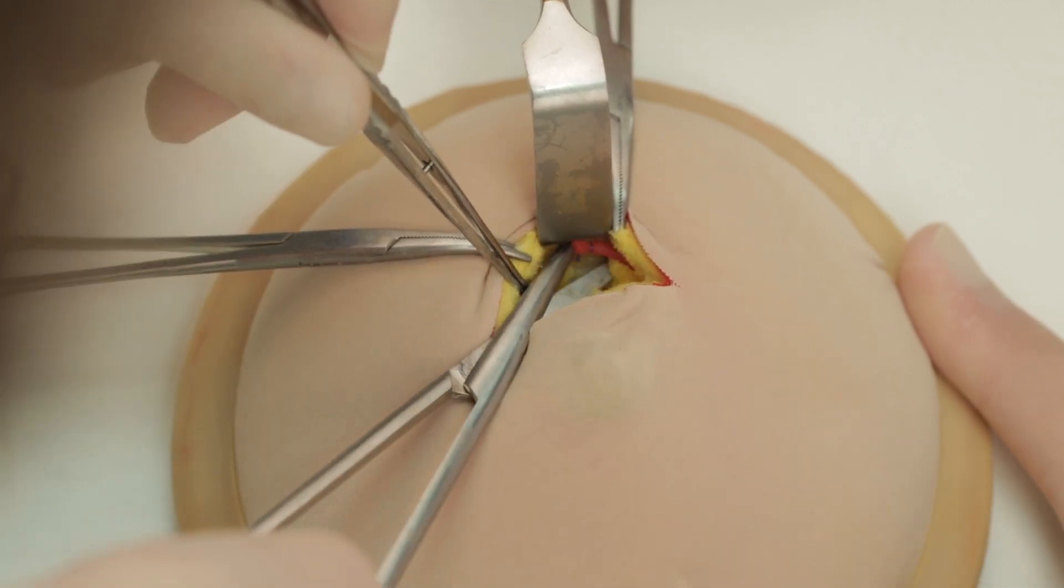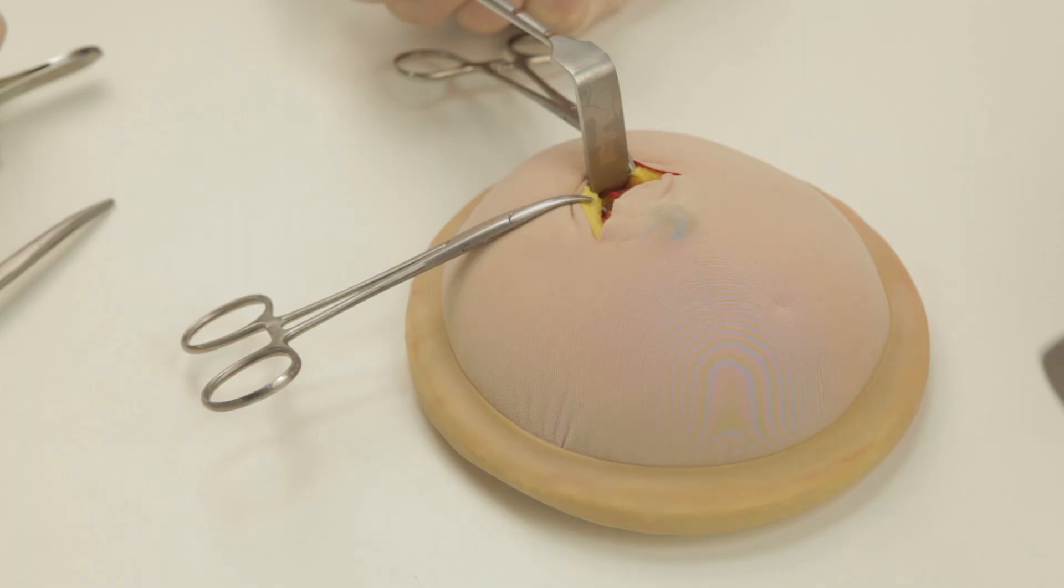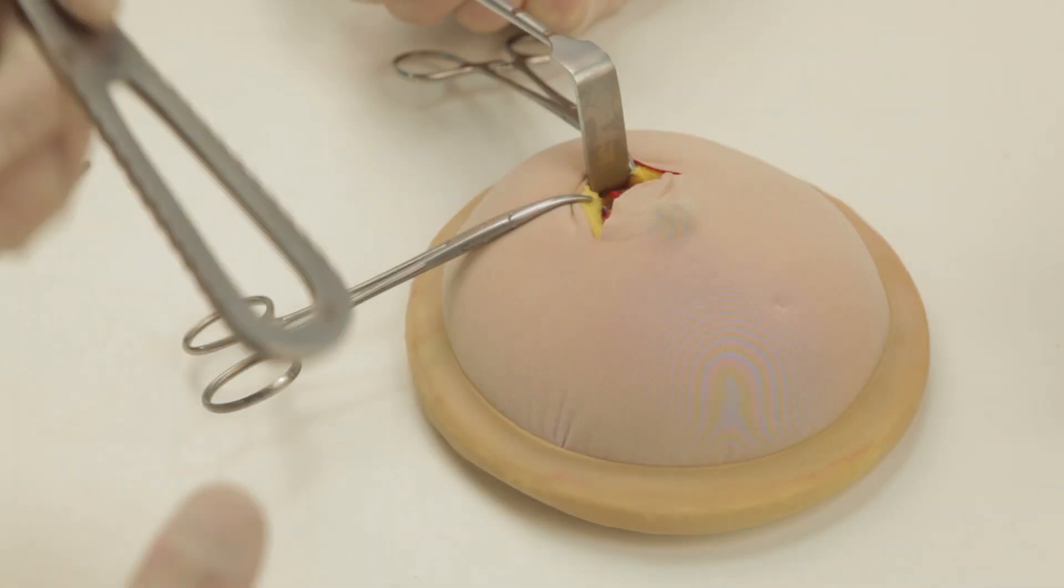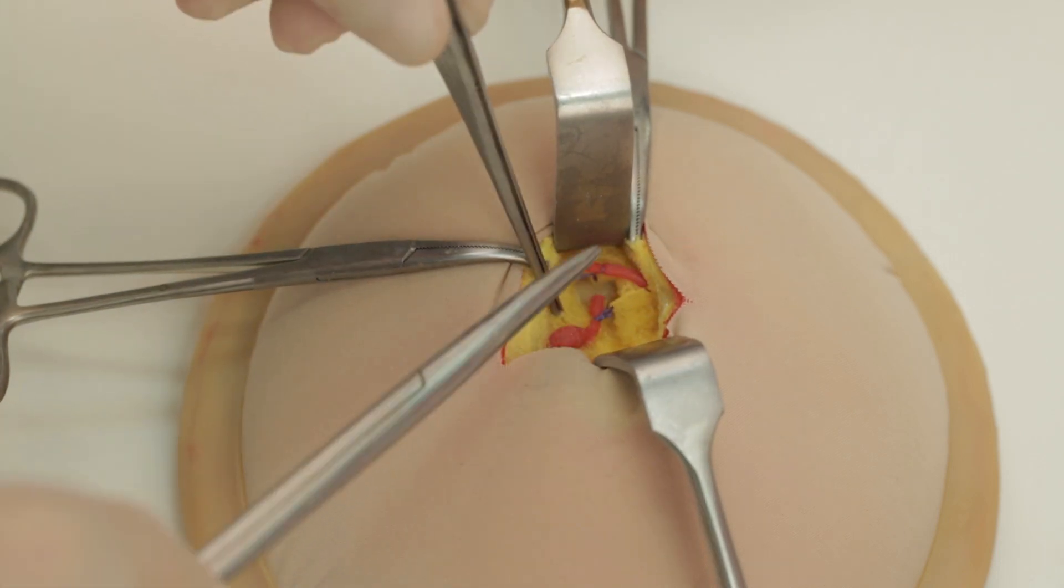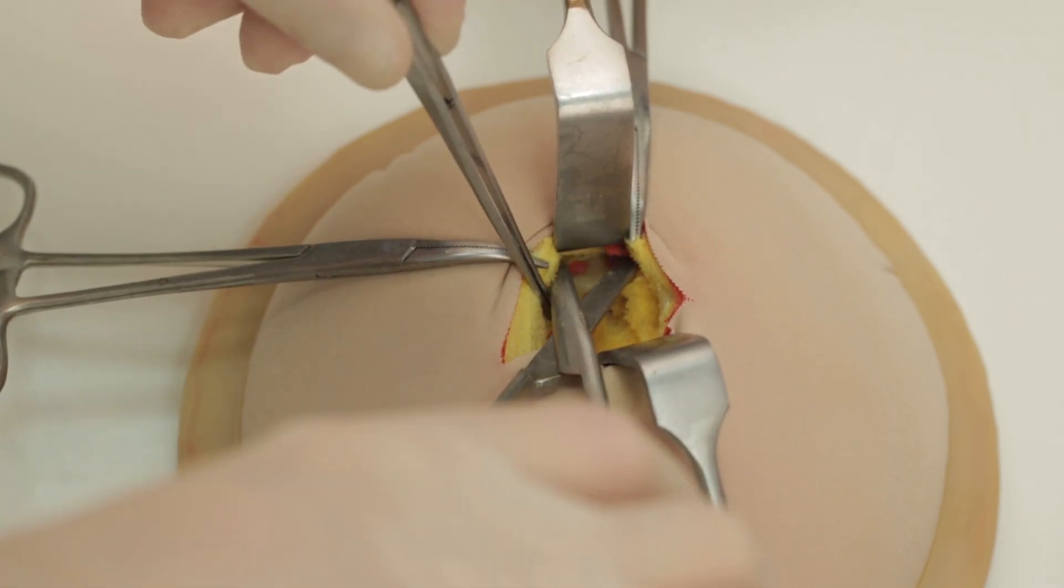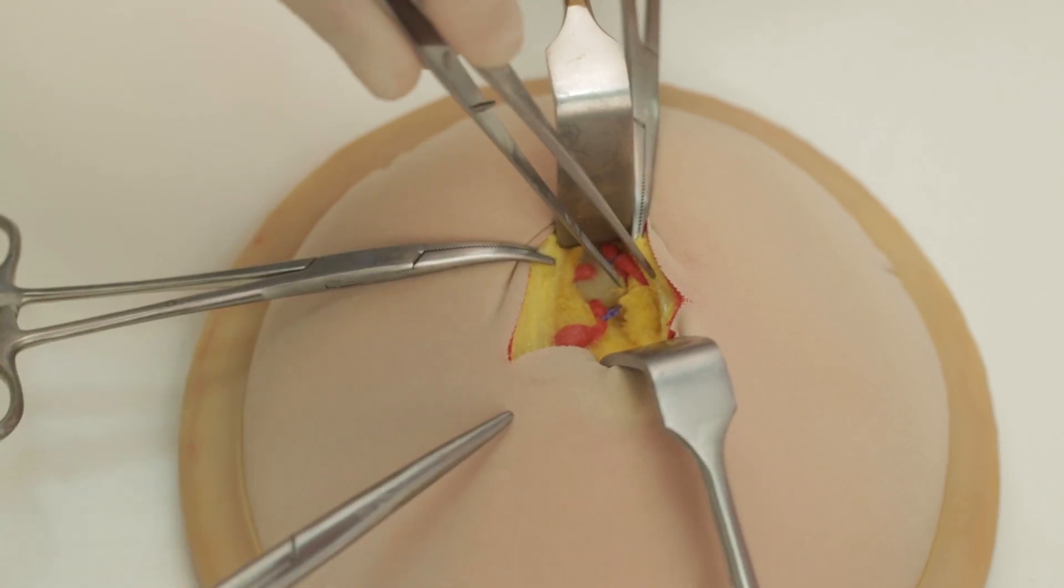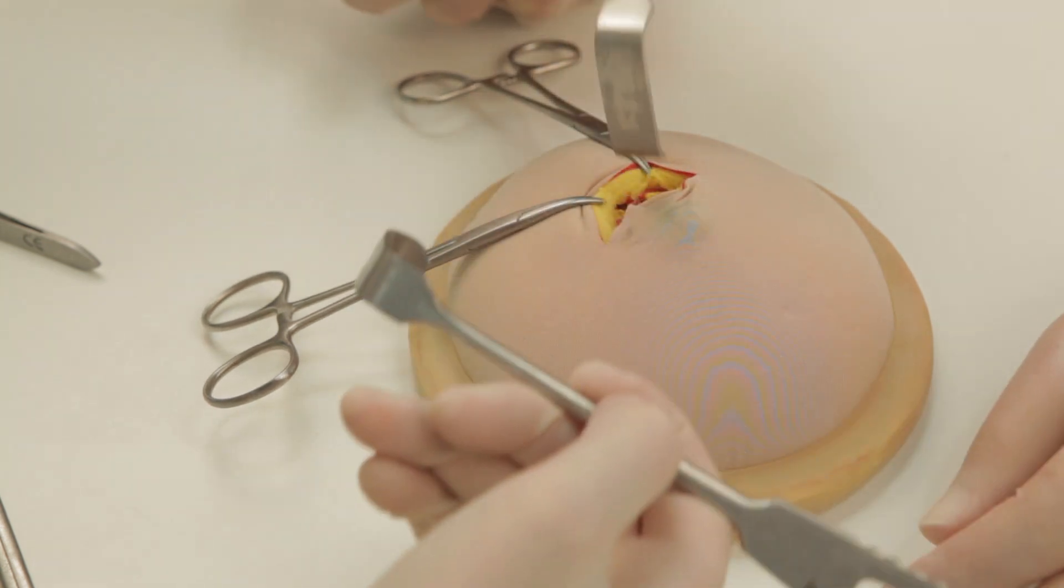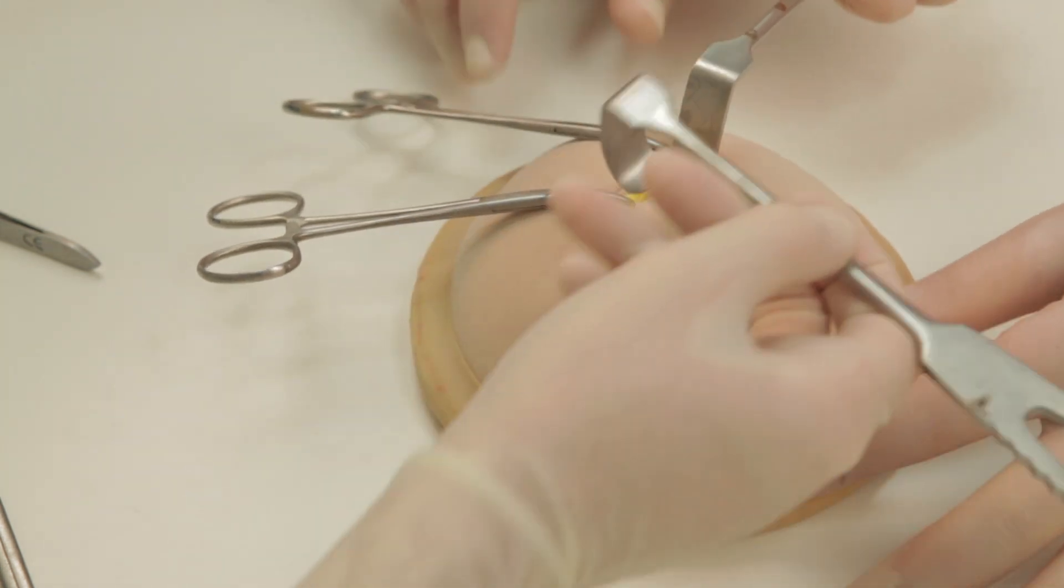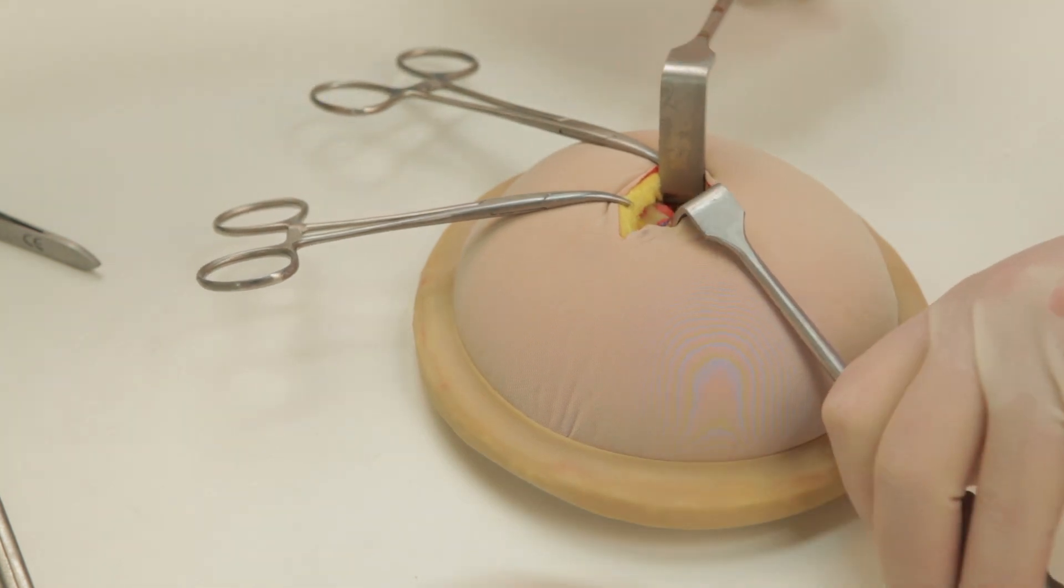The lesion is just visible. Each of the lesions in these models has two or three blood vessels attached to them. You must ligate these blood vessels before removing the lesion.